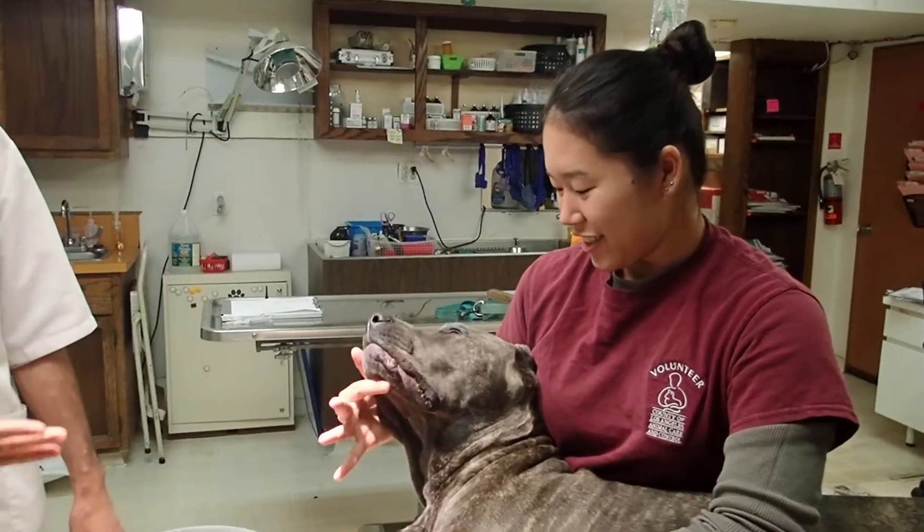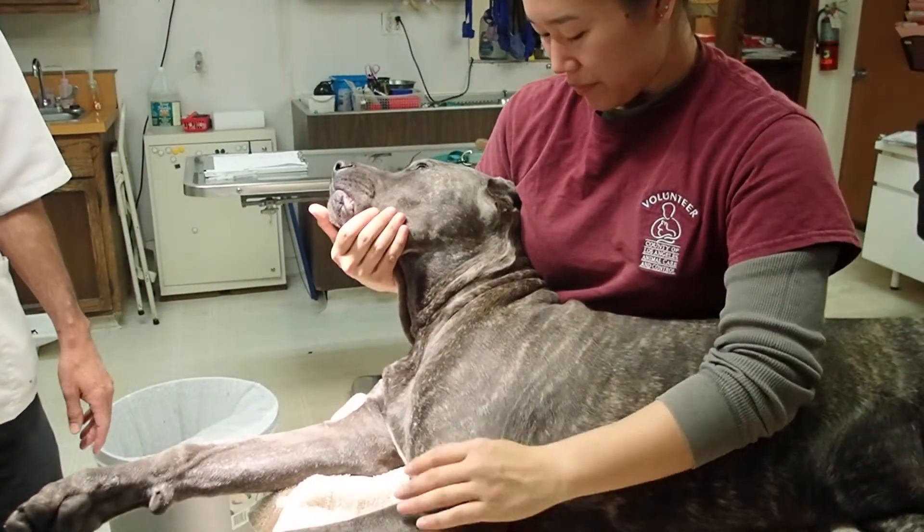Good morning. I'm Dr. Andres, and this is my assistant Madison. Our patient today is Zena, a nine-month-old female spayed mastiff.